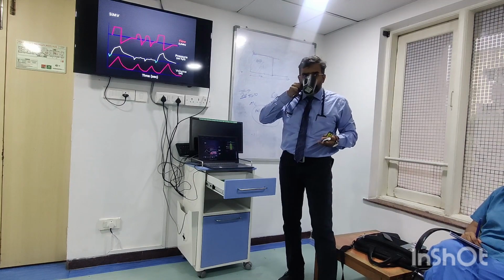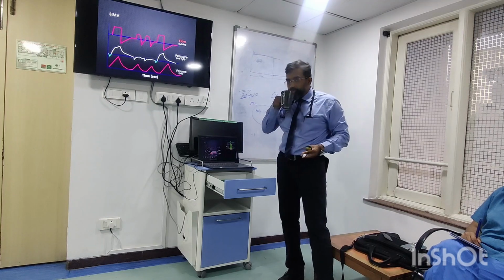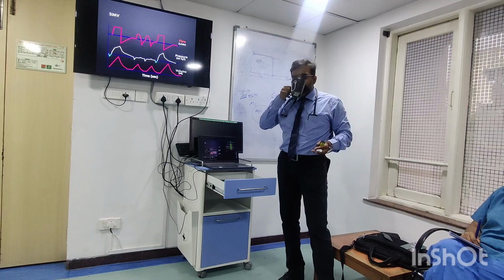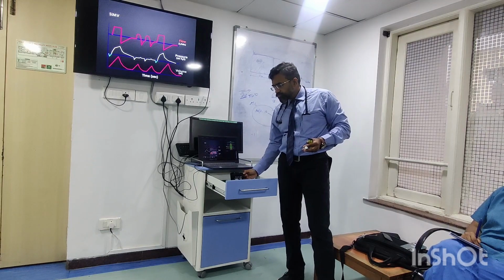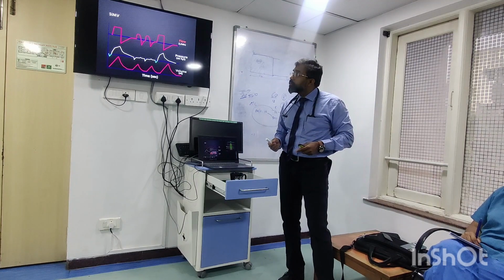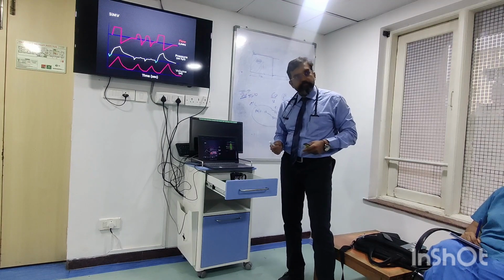So trigger by ventilator. Look carefully. No, sir, your patient. Then limit. No, patient trigger, okay. Patient trigger. Limit by volume. Limit by volume.